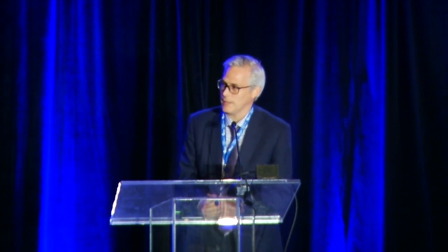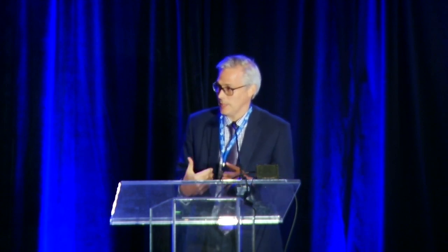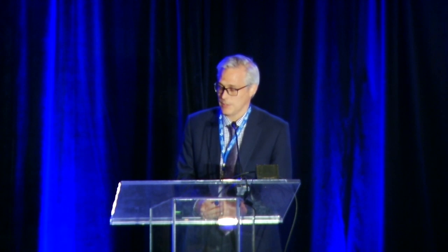That's a great question, Raj. I think the first issue is awareness and more global adoption. I think a lot of people don't know when to use them or what particular indication. And for me, it's been a learning curve. I think the second question you ask is excellent because if you plug in NIRS, you can do some Cambridge analysis to determine, are they autoregulated? Are they trending towards spasm? And use it in your management. I'm a fan of them. I don't use them on all my patients, but I don't know why other people don't use them more widely.